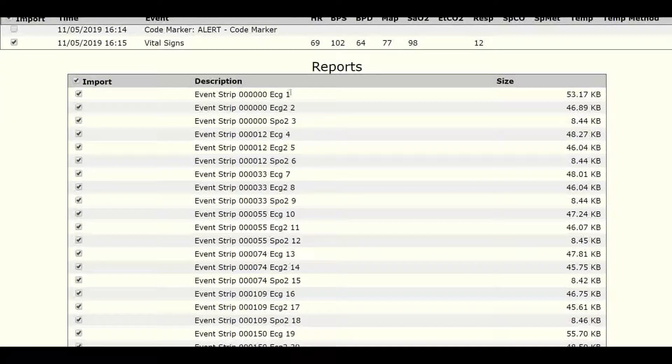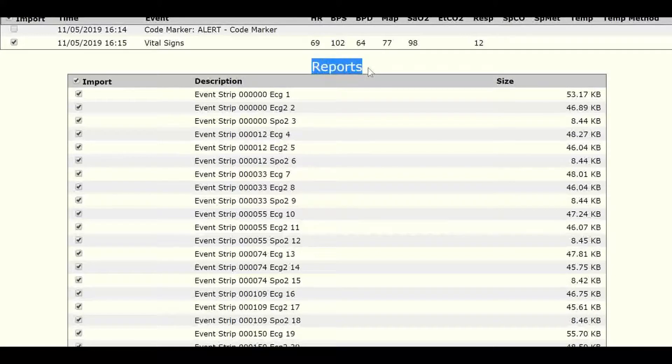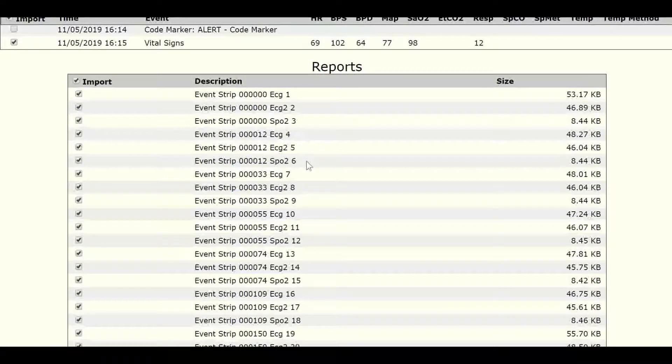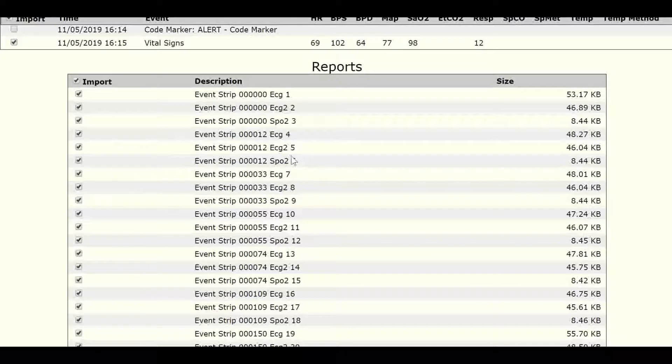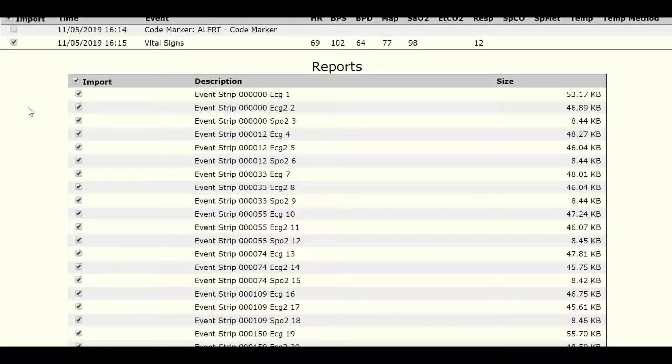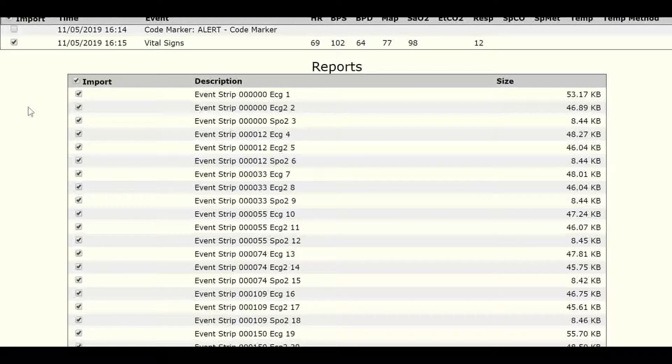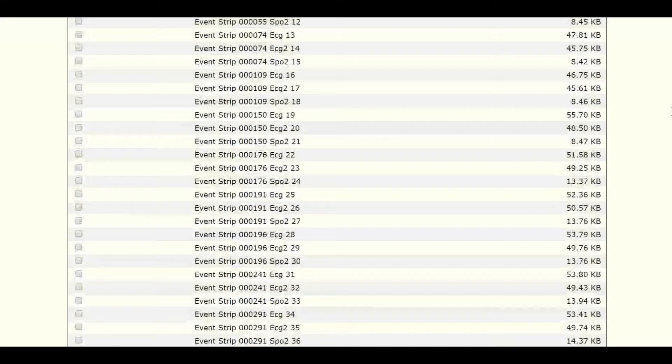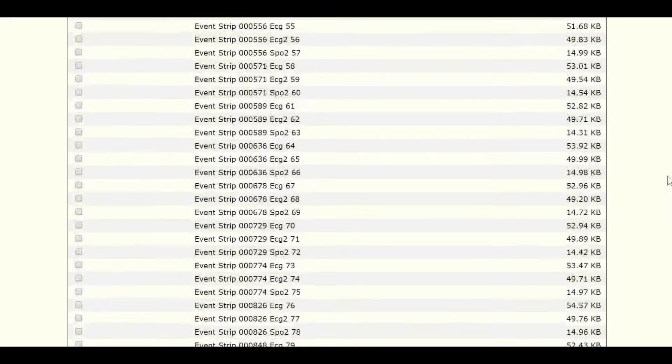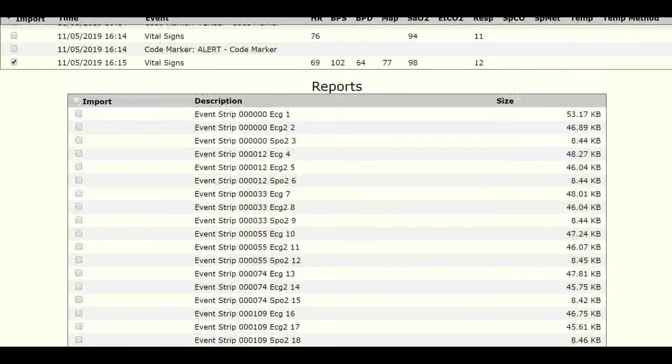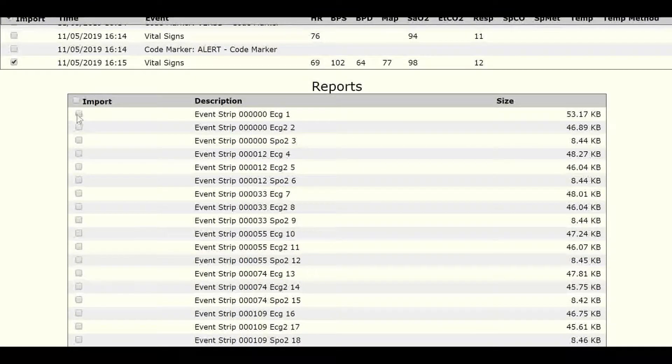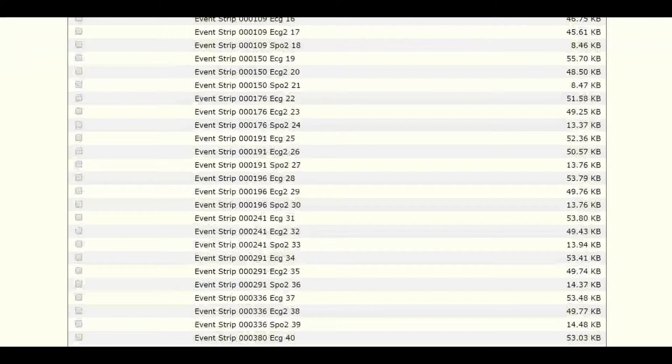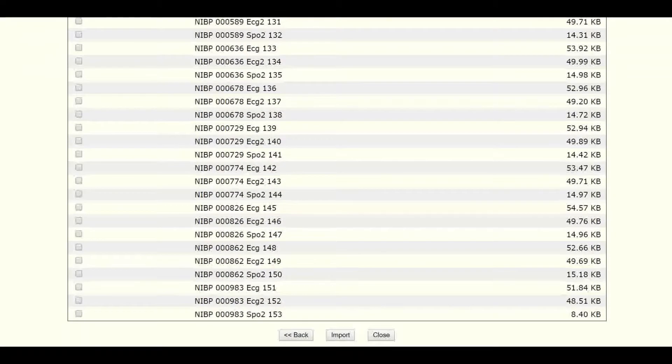The second block is called Reports. These are actual image files that will be inputted with your call sheet in terms of 12 leads, snapshots, maybe alarms that happened during the case where the Zoll Monitor decided to save something that happened. Here, you'll generally want to deselect all of them, and then reselect only the strips that you want, because there can be many, in this case, 153.